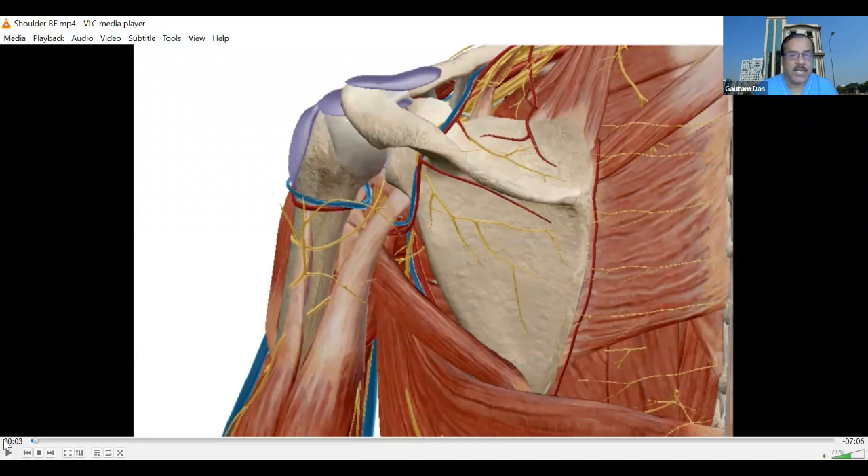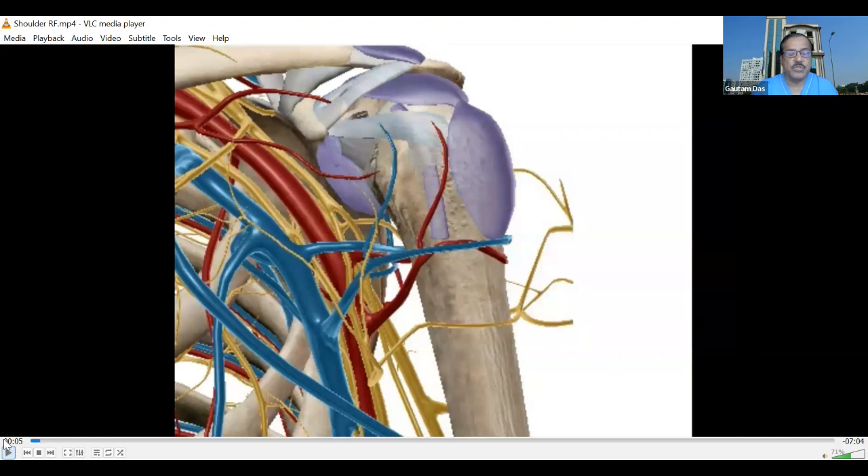Anteriorly, another important nerve provides articular branches — the articular branches from the lateral pectoral nerve. It comes through the coracoid, at the entry to the coracoid. This entry to the coracoid is another important target for denervation. Here, the other important arteries and nerves are a little away, and placement of the needle is superficial and precise.